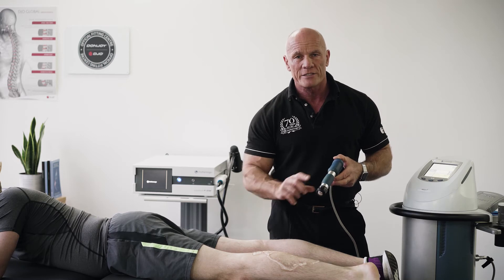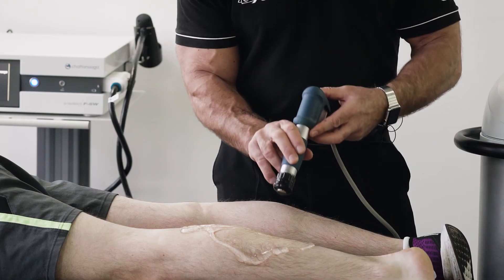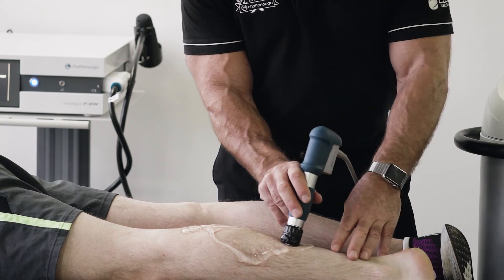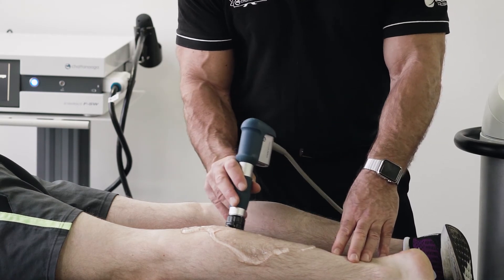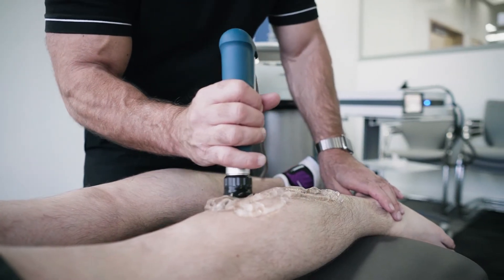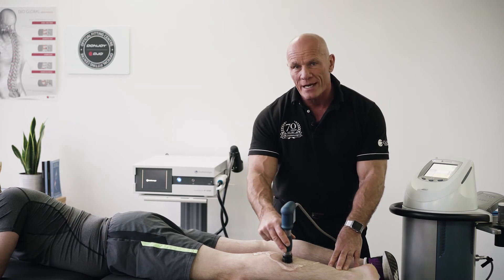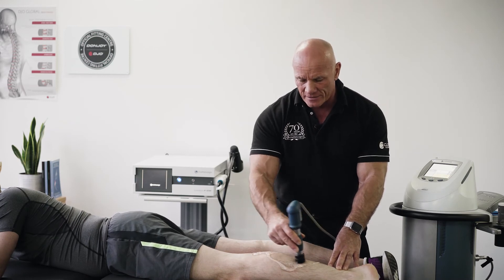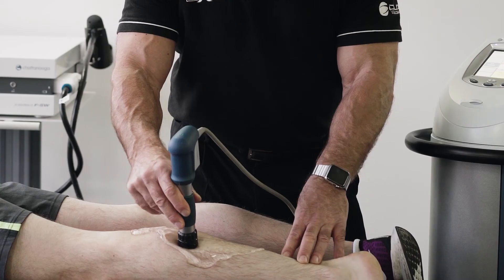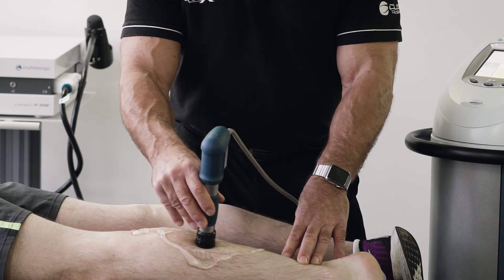You can find this through palpation or indeed using your machine. Use a light grip on the handle with plenty of gel. You'll find that over normal tissue it glides nicely, but where we have a trigger point or where the fascia is bound down, you'll find that it drags. This is also the area that the patient reports as most uncomfortable, and this is the area that you should concentrate your treatment on.